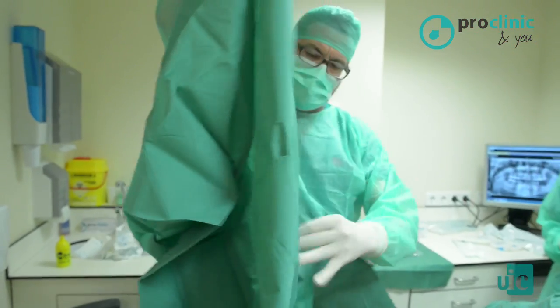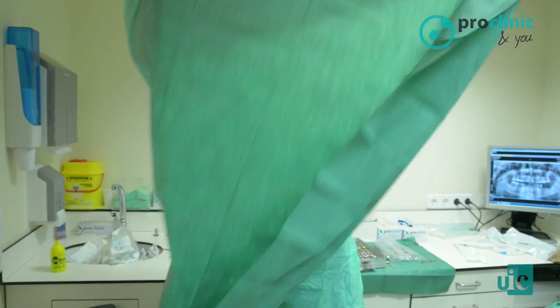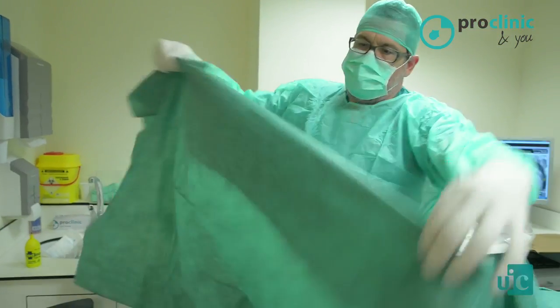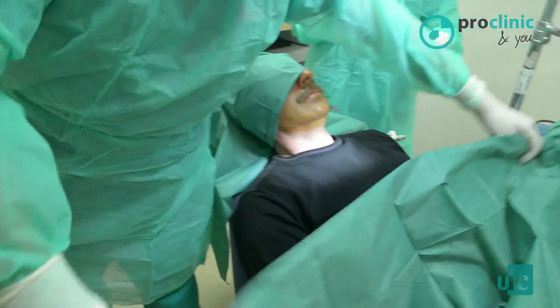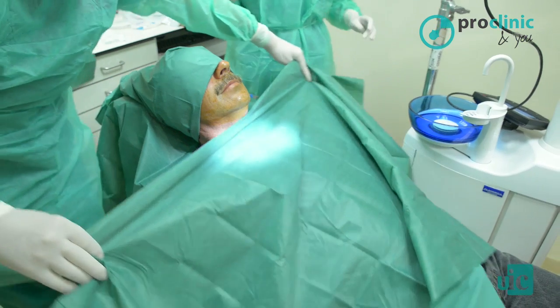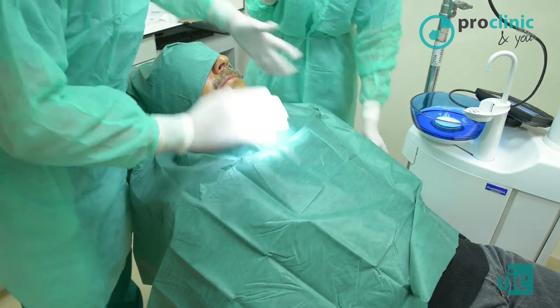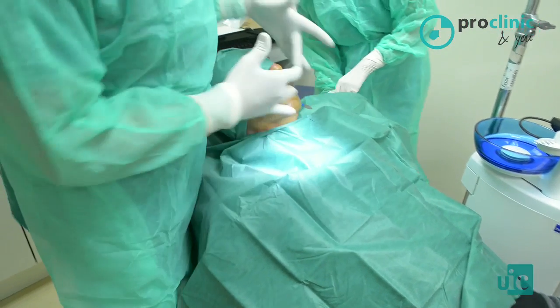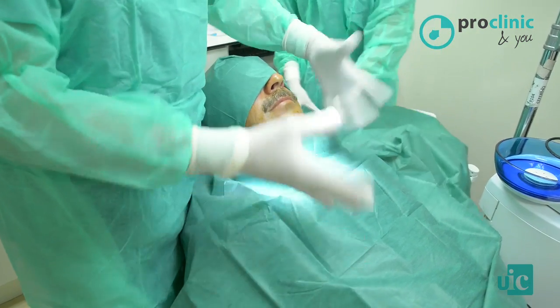We use a bigger one. It is very big, so we fold it again and pass it over, and we finish. Now you have the apron on, patient. See? Now we have a sterile surgical field and the skin disinfected, so we can touch the surgical field and we are ready to work properly.